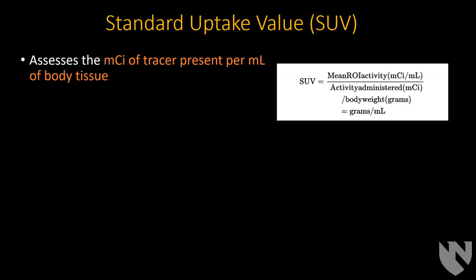So if the patient was a big bag of water and you injected a certain amount of radiotracer into it and then let it diffuse everywhere and also accounted for how much it decays, everywhere you measure, your SUV would be 1. It should uniformly have the same amount of radiation everywhere, exactly as you would expect. But a patient doesn't work like that, so certain areas like the subcutaneous fat and the lungs will have a lot less radiotracer relative to other parts that will have higher uptake, like the liver or the kidneys.